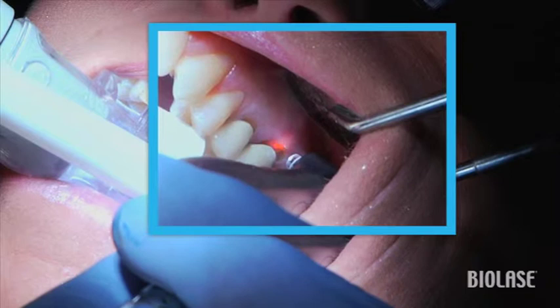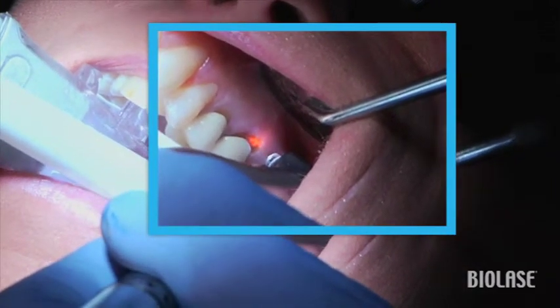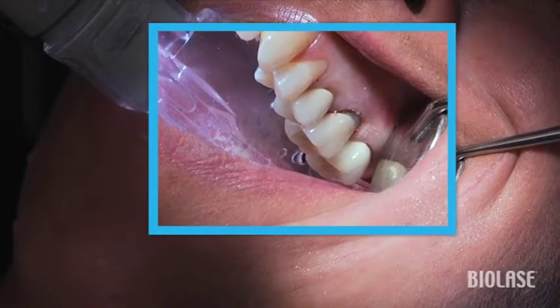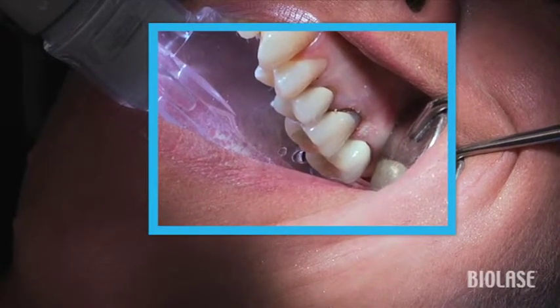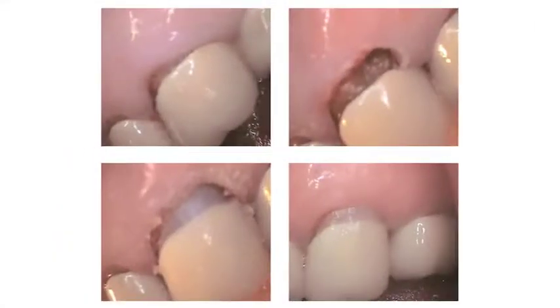Interestingly enough, both the gingivectomy and caries removal were done just using topical anesthetic. Lasers allow me to turn what was once a difficult procedure into a great experience for both patient and doctor. These post-op photos show the nice healing of the tissue one week postoperatively.